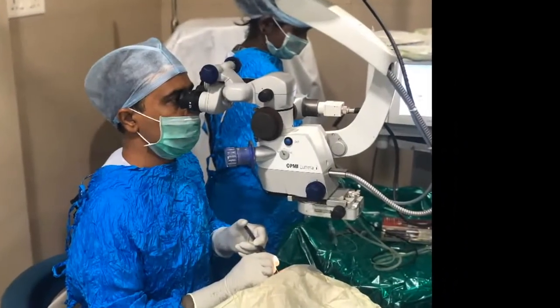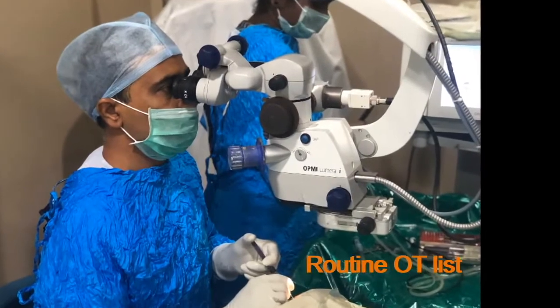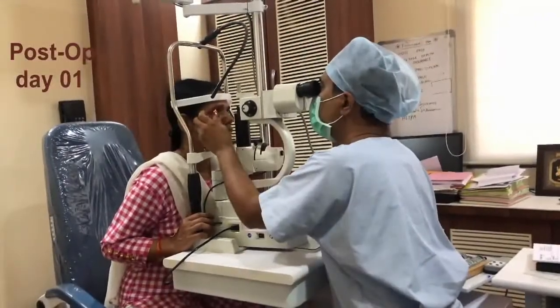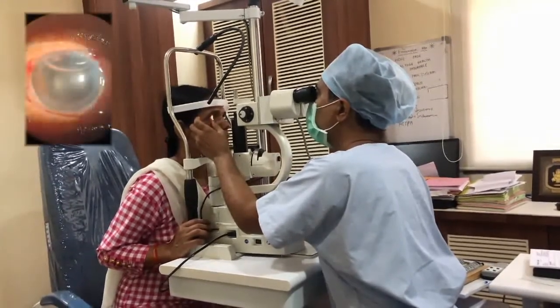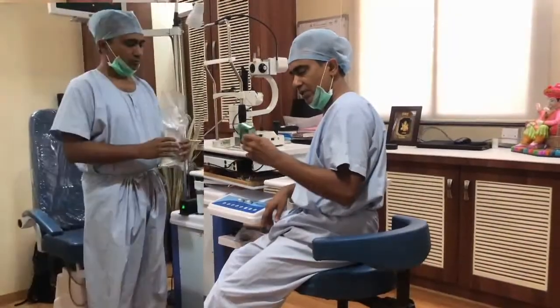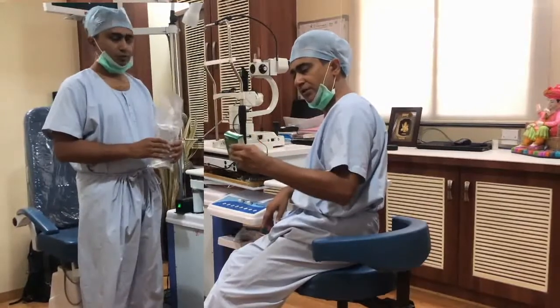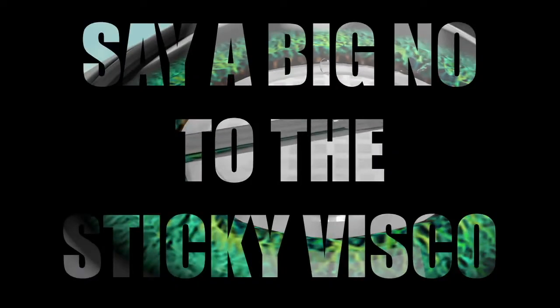Hello friends. After routine cataract surgeries, postoperative surprises are not uncommon. On postoperative day 1, sometimes I get really annoyed due to postoperative rise of IOP and inflammation caused by retained viscoelastic. If visco is the culprit, can we use only BSS for the surgery? Here we present our technique of visco-less phaco — say a big no to the sticky visco.